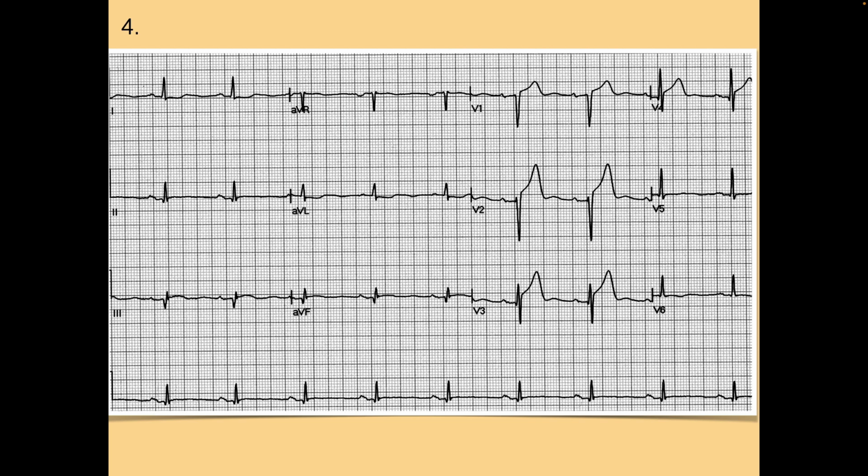You're just looking for septal anterior. If you don't see a septal anterior and you happen to see something else, you might as well jot it down because I'm going to ask you. A patient having a massive heart attack. It's not septal anterior.